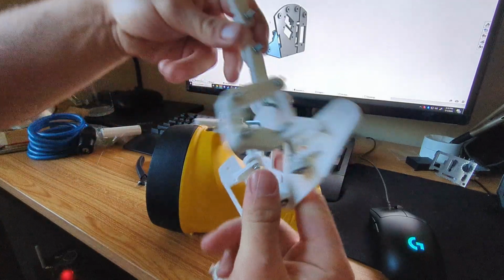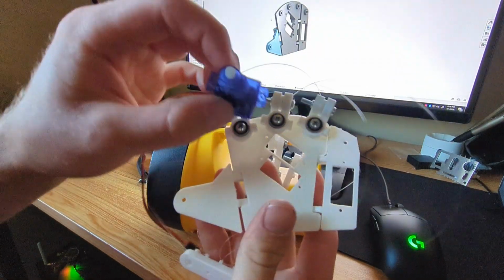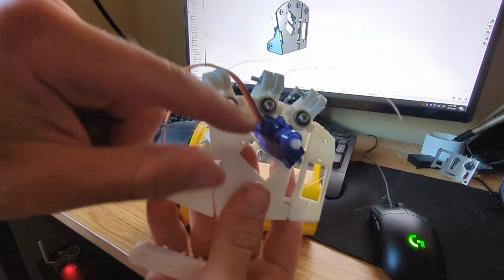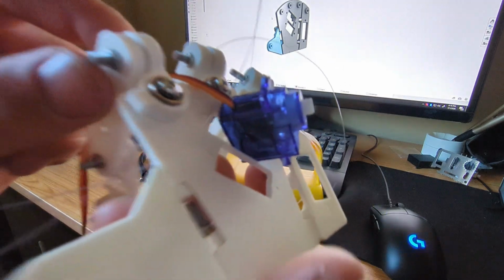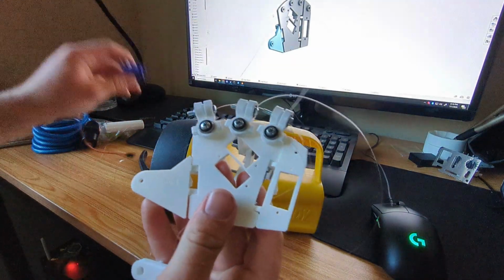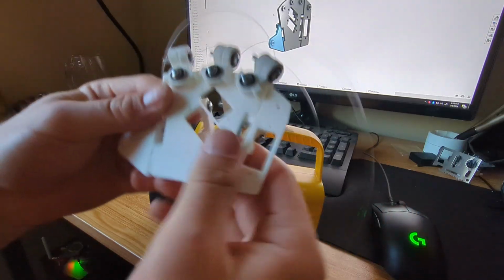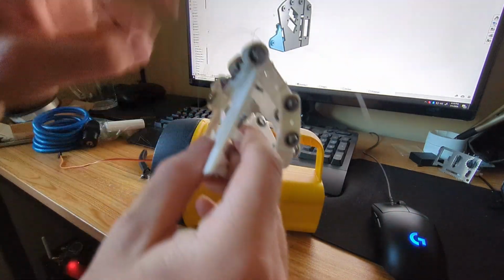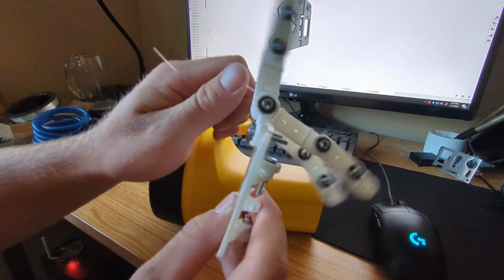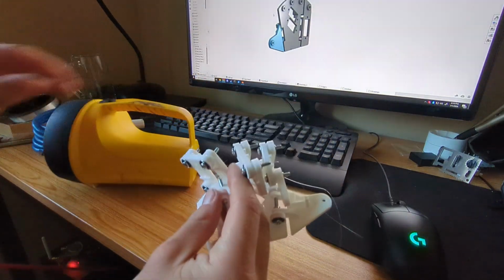Other thing of note, these blue servos, they almost fit in these slots, but the slot's very tight and the wire here gets in the way and prevents it from slotting in properly. So I'm gonna go ahead and resize those slots. I think these slots are probably unnecessary, and I'll be moving them to somewhere else. But I mean, there it is. Call it really prototype 1. I printed some fingers before and they did okay, but these ones are actually working, so that's very nice.